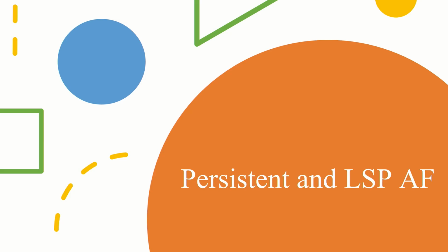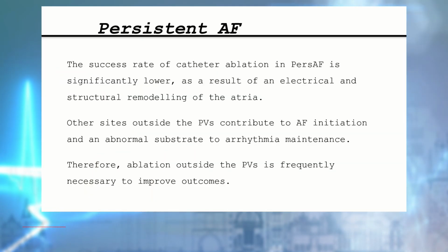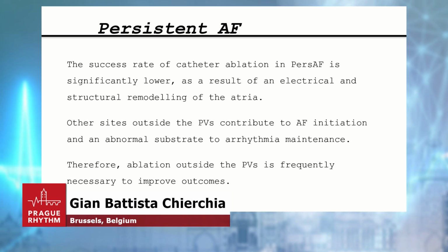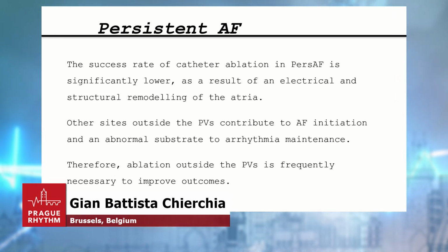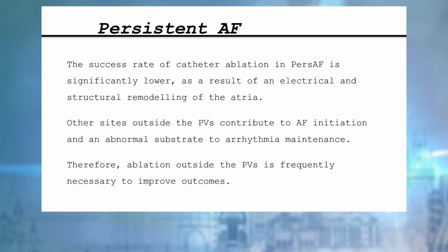These are my last slides. I strongly believe that today we do have methods, and we have matured the experience to perform safely PVI also with thermal energy. But I believe that in the field of persistent AF, PFA permits us to be more audacious, bolder, let's say, in getting outside of the PVs and ablating substrate, in a way feeling safer than you would with the thermal energy.